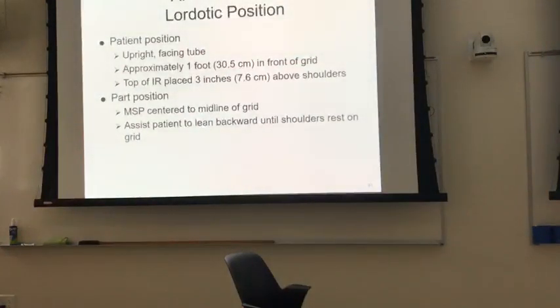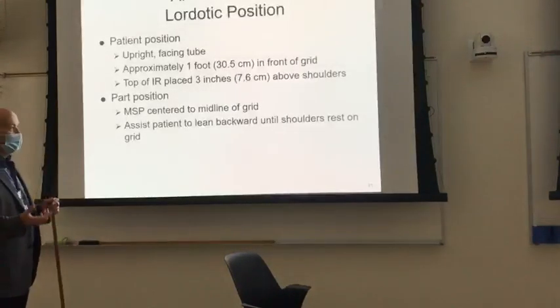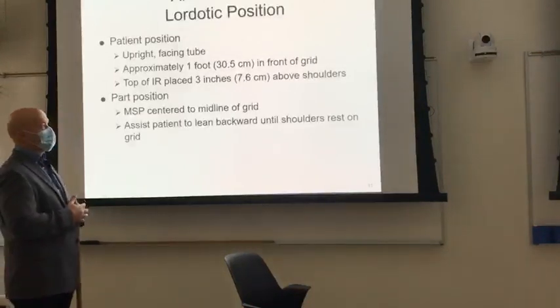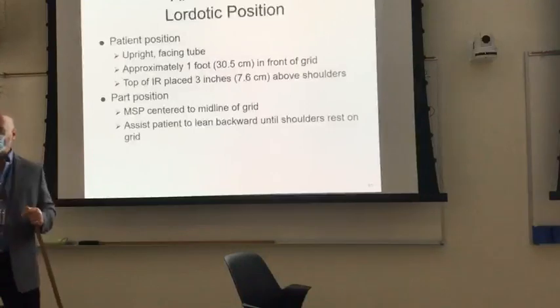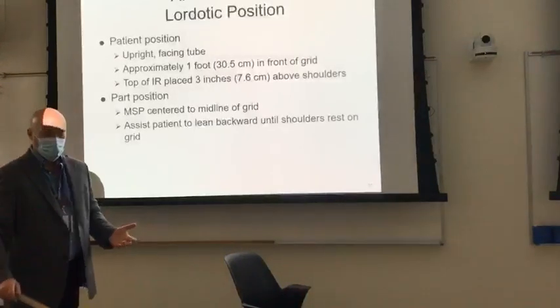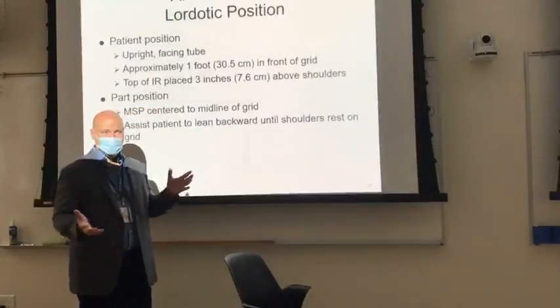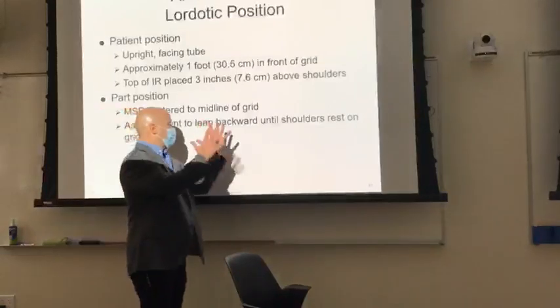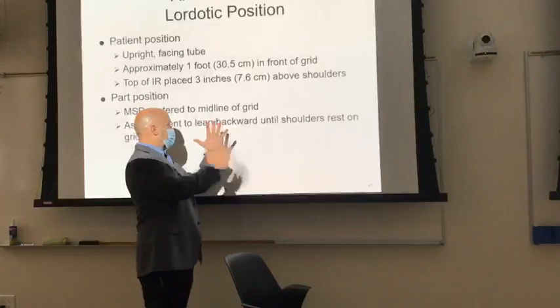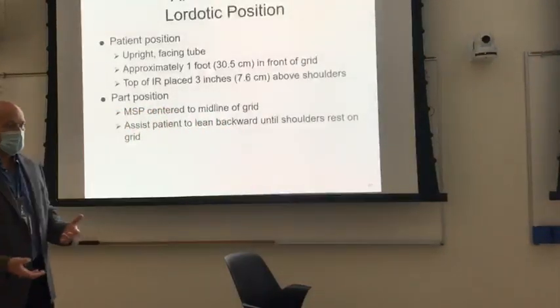So once in a while we'll have a patient where they've got some pathology, maybe TB, in the apex of the lungs. So we need to see the apex of the lungs with as little superimposition as possible. So superimposition is just where we've got one thing stacked on top of another thing, okay? So how many shadows of the hand do you see there? 1, yeah, but we've really got 2. So superimposition just means one thing stacked on top of another.